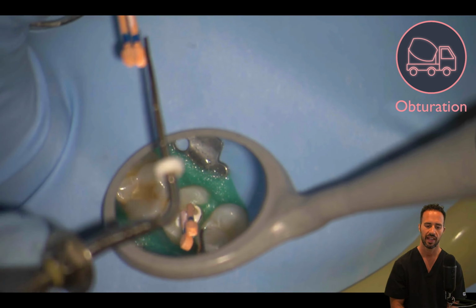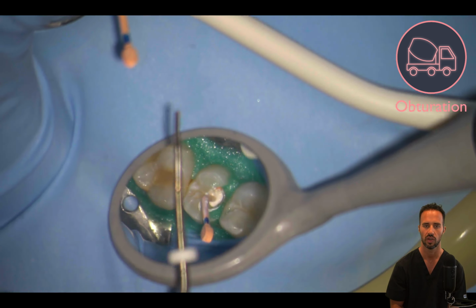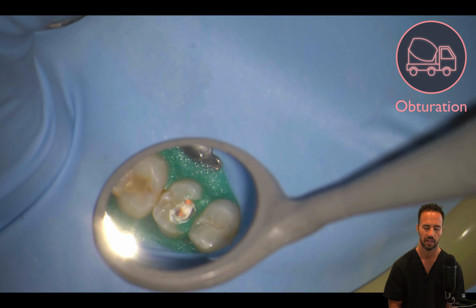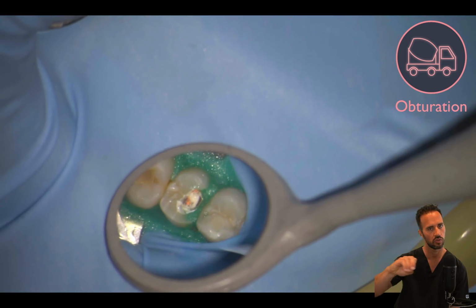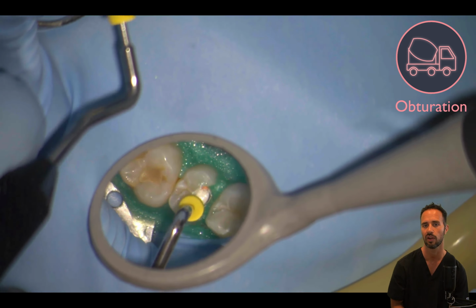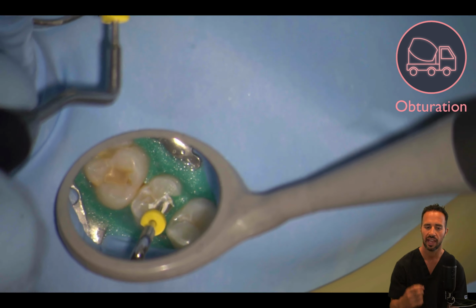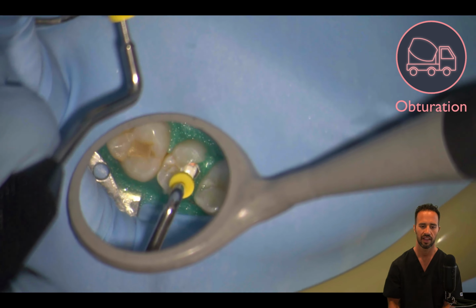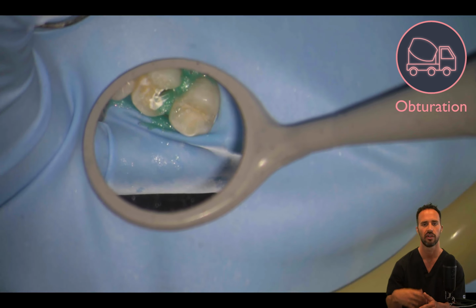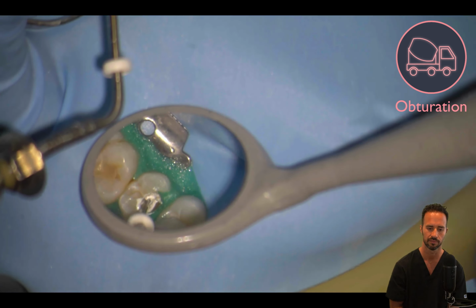So now we're going to go ahead and sear off the gutta percha cones right at the orifice and get into our compaction. Okay, that System B tip there is used. You don't have to go too deep into the canals. You just want to have enough to work with and enough to compact at that orifice level. And we're compacting with our Buchanan hand plugger size 1, that's the red, and we're using the larger size of that red plugger. And that's the plugger that I use for 90% of my cases. Okay, and just kind of packing that down.